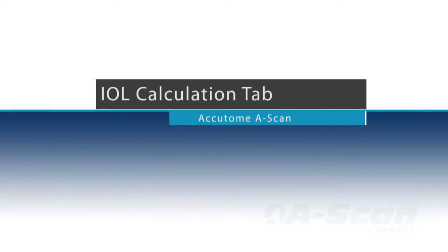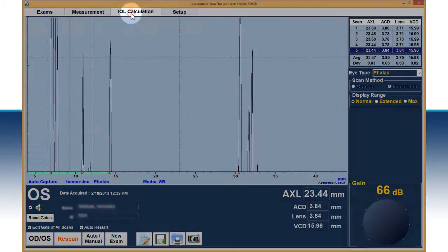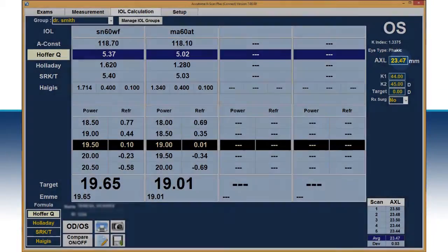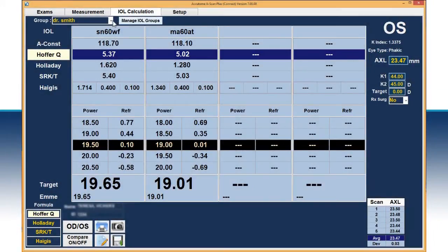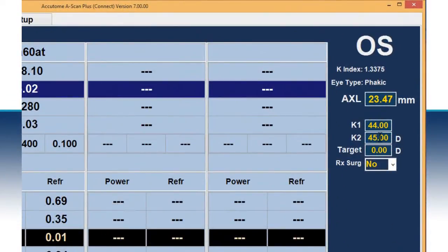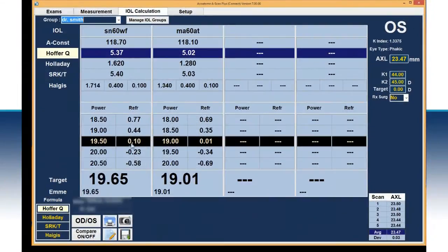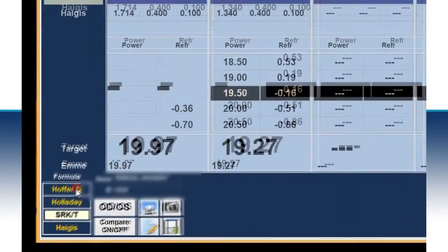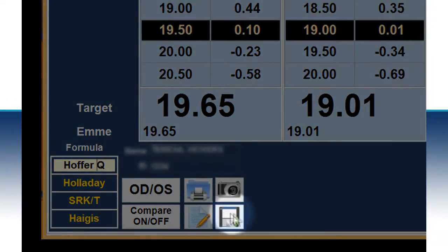Once the scans are completed, select the IOL calculation tab. The average axial length will automatically be transferred to this screen. Select the appropriate IOL group. Input the K1 and K2 values. Make an adjustment to the refractive outcome target, if desired. Select the appropriate calculation formula. The IOL power recommendation will appear in bold for each lens. It is important to select the save icon at the bottom center of the screen to save all information.